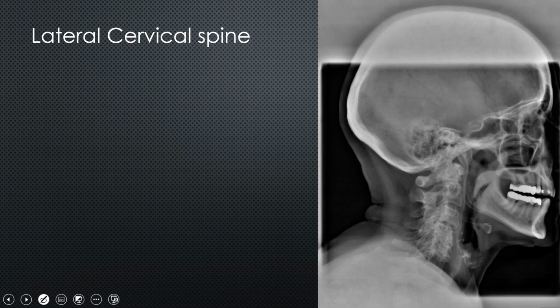Alrighty, next we have a lateral cervical example here. When we're taking a lateral cervical spine, you want to make sure that we are getting at least from our sella turcica down to our C7 segment. So I can definitely see the sella turcica. And here is 1, 2, 3, 4, 5, 6. I think this is probably C7 here as best as we can see it.